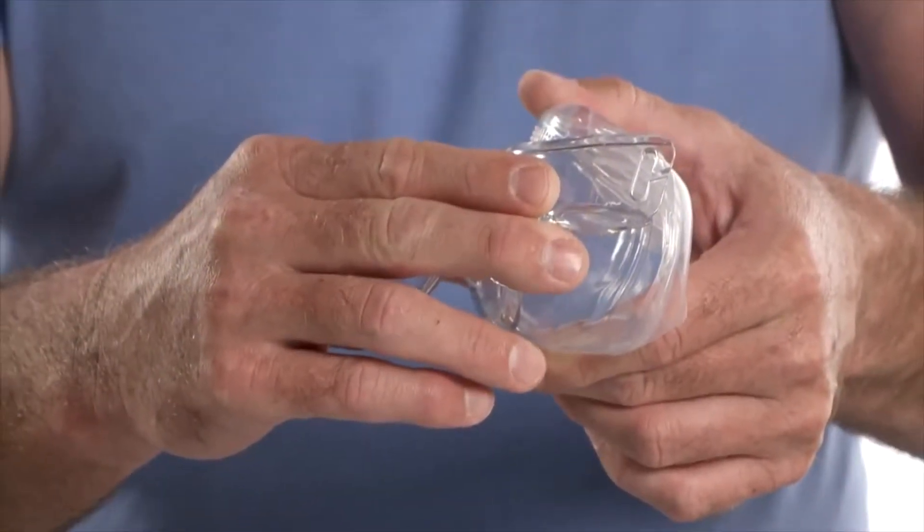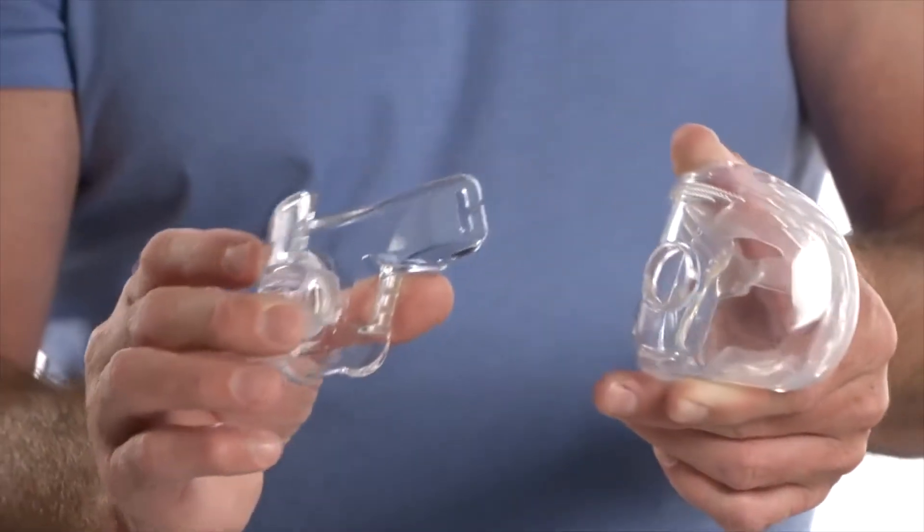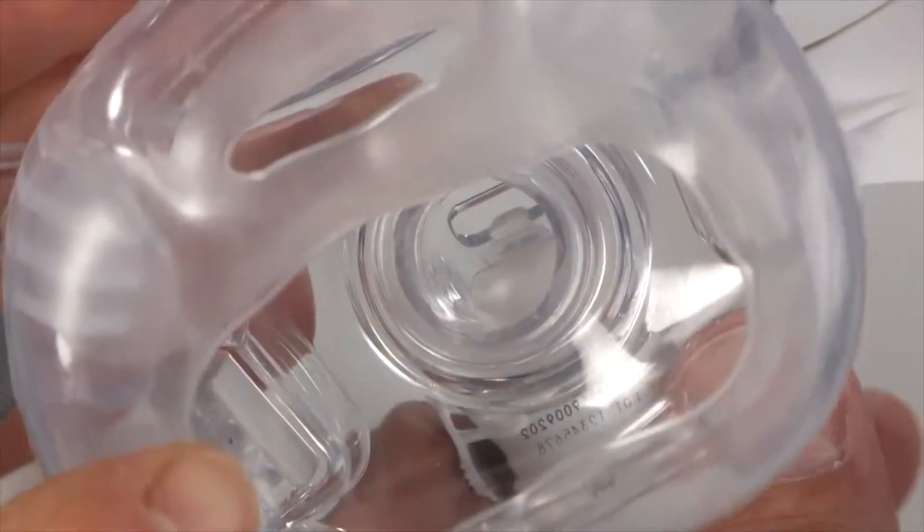Grasp the top and bottom of the mask cushion and gently pull it away. Do not pull the mask cushion by the nostril cushion opening.